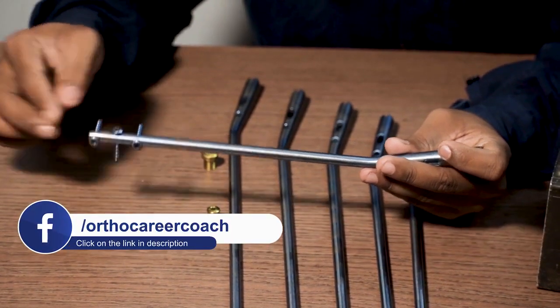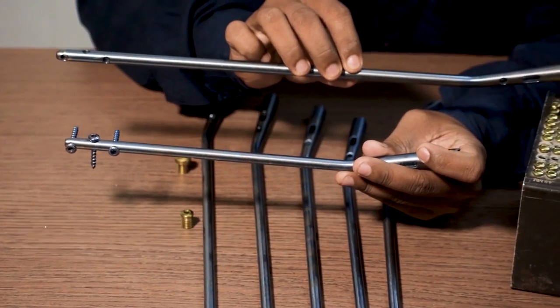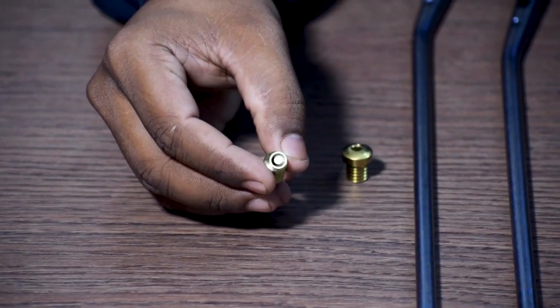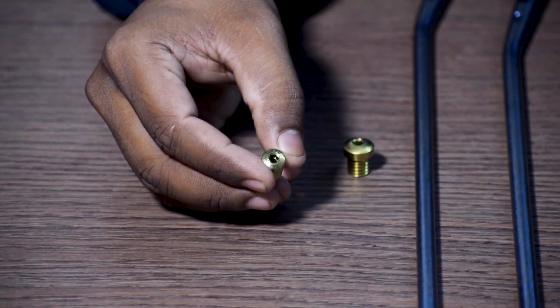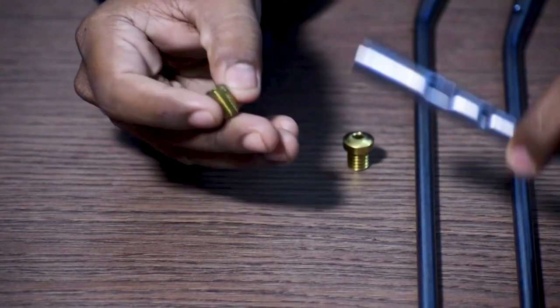This is an 8 mm diameter nail, which will be fixed by a 3.9 mm interlocking bolt. For the 9 mm tibia interlocking nail, a 4.9 mm interlocking bolt will be used. This is called the tibia interlocking nail cap or end cap. It is available in 0 mm, 5 mm, and 10 mm, and is fixed in the proximal part of the interlocking nail.